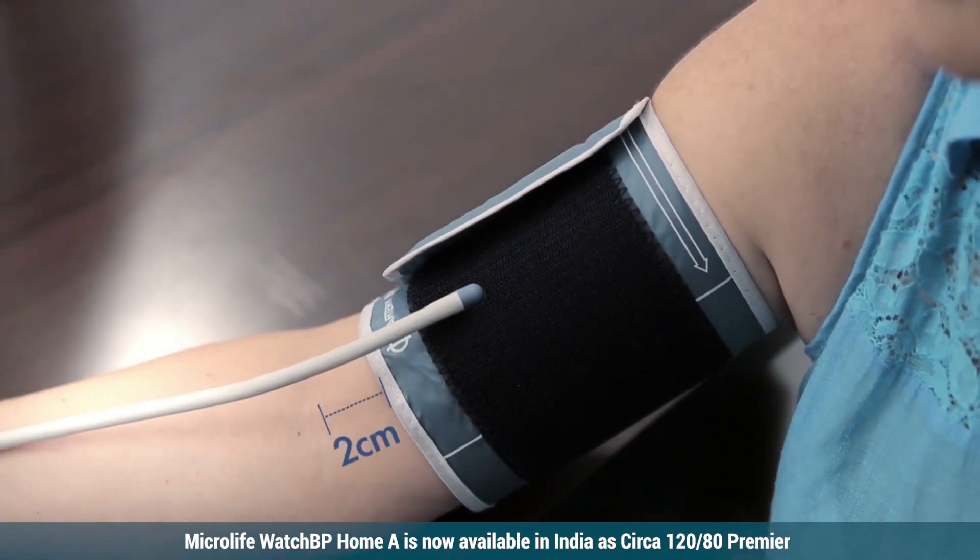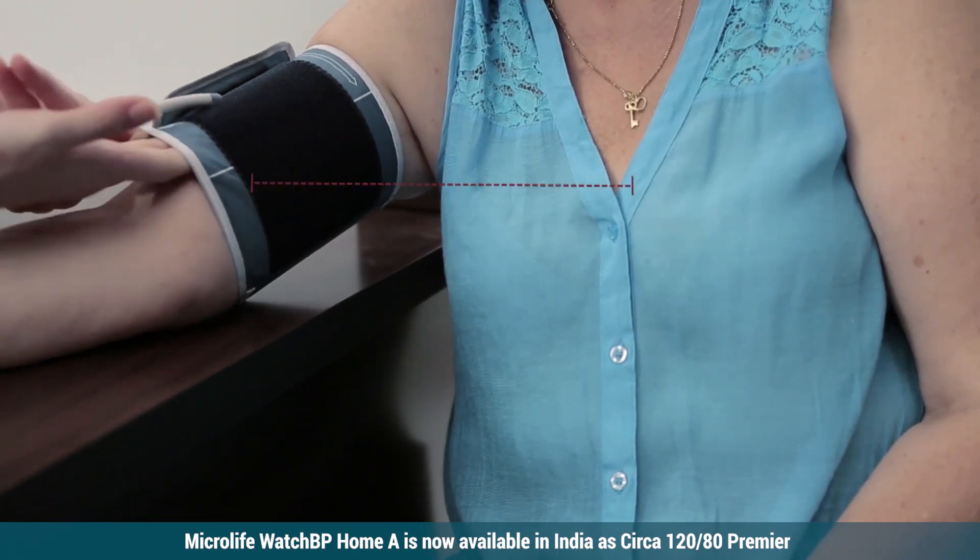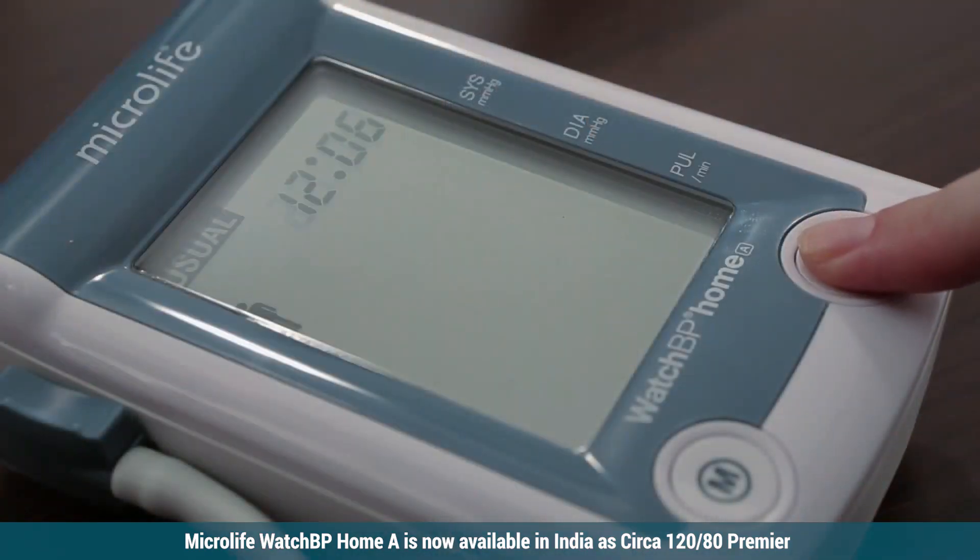The tube connecting the cuff to the device should be placed on the inside of the arm. Ensure that the cuff and arm is at the same height as your heart. Press the start button.